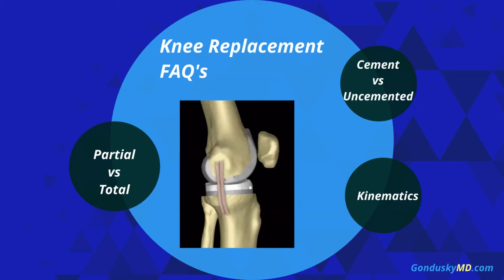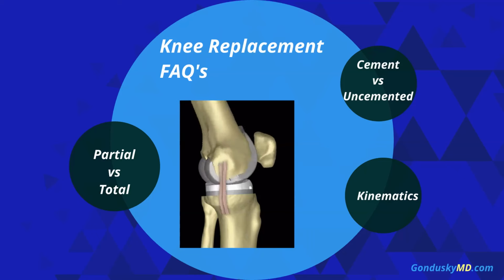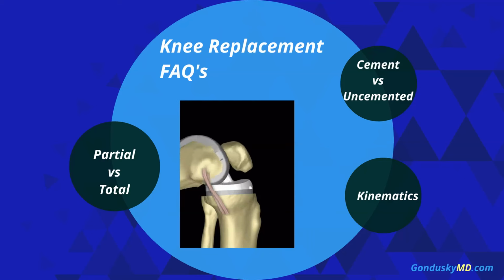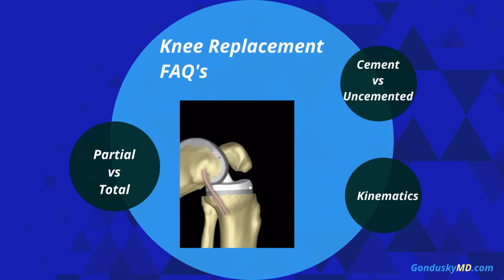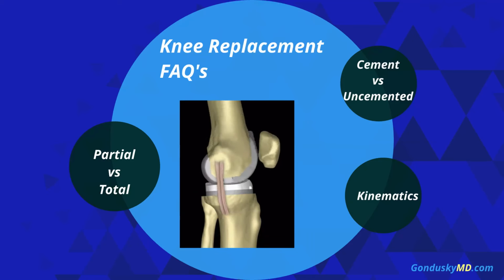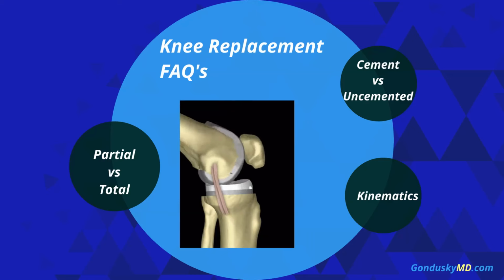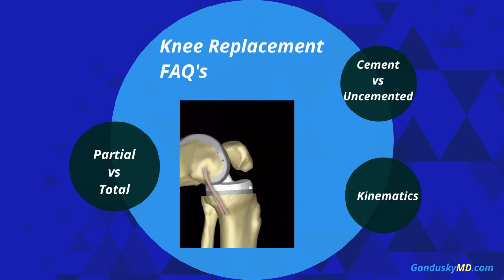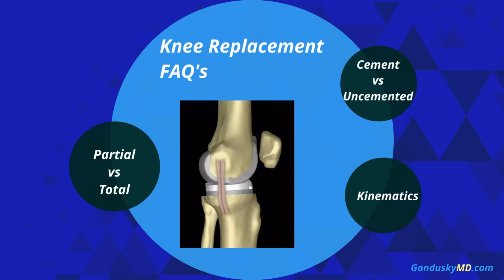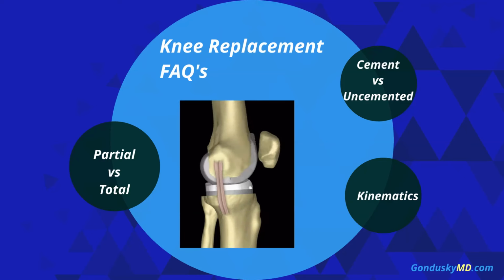This was common a longer time ago, but it's still not too uncommon a question, which is, are there knee replacements for men or women? There's really not any difference between knee replacements for men or women. Probably about 10 to 15 years ago, there was sort of a fad of knee replacements for men or women, claiming that the knee was different, and it turned out that this really didn't bear out in how patients did, and therefore this is a non-existent issue at this point.